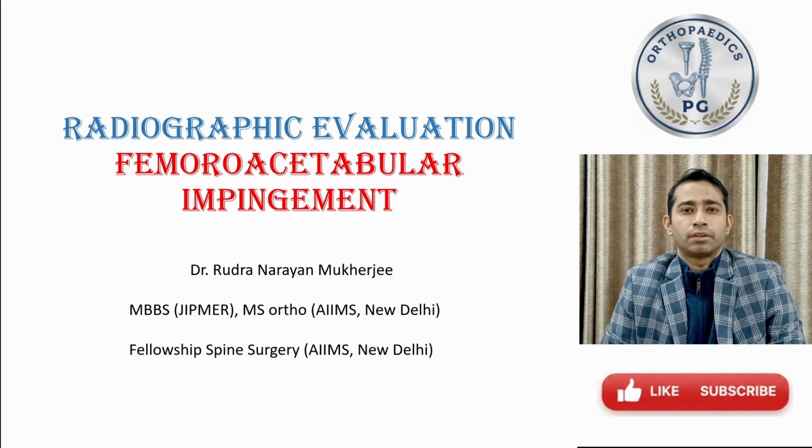Welcome everyone. In today's video, we will talk about the radiographic evaluation of femoroacetabular impingement.